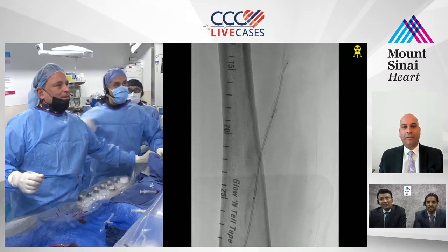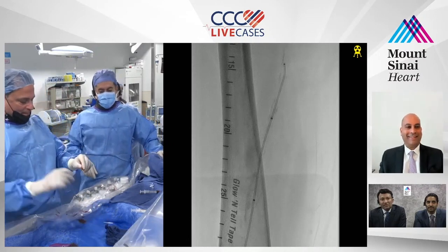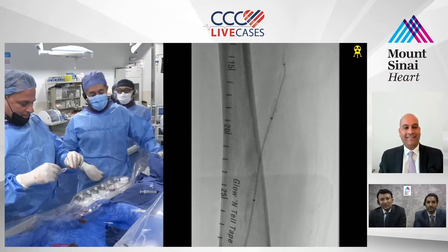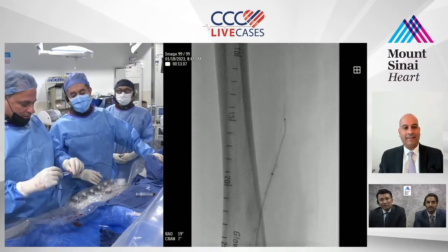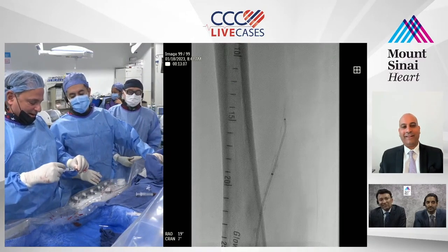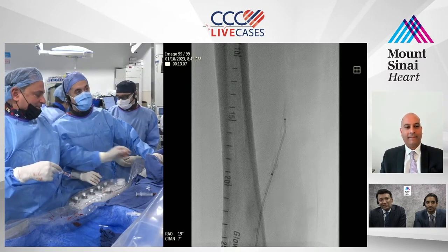Contrast right there. Do we have blood flow? I assume we have blood flow at this point. I was just going to hope. Yes. I can see it dripping out of that overnight. It's an 035. That's why I'm scared. Oh, yeah. Oh, boy. There it is. This is what happens.